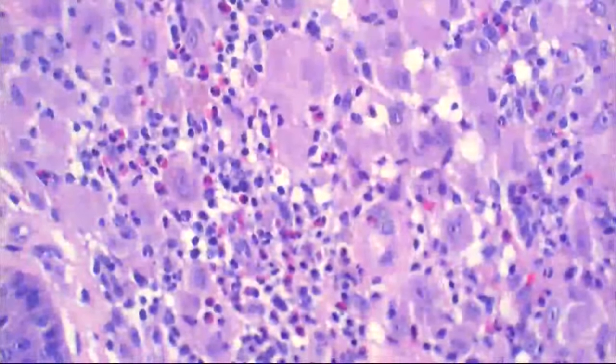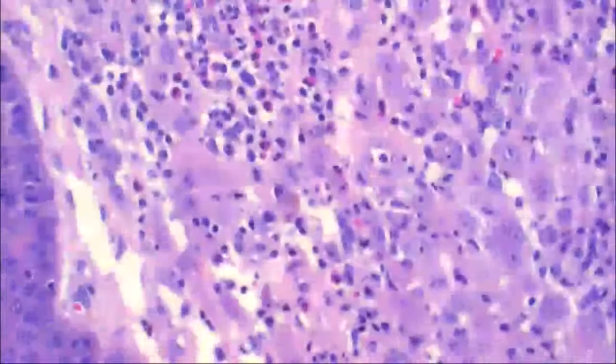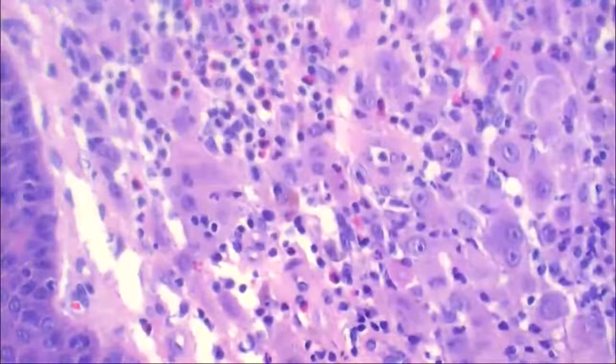Spitz nevus. Oh yes, okay. Cells of the Spitz nevus can sometimes simulate that. So here's a couple of examples of this. The one on the right might have been one of the patients who had arthritis associated with it. Okay.